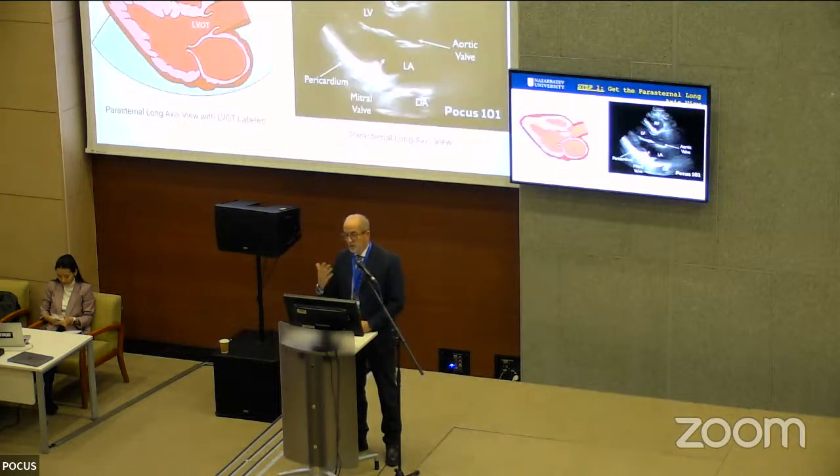Okay, so let's go now step by step. We need to measure the LVOT area. And in order to do that, we measure the LVOT diameter.